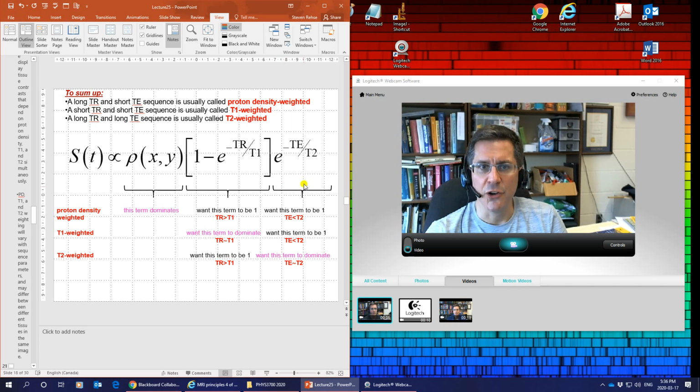All the action is right here. And you ask yourself, is this term 0, which means dark, or is it 1, which means bright? Just ask yourself that. And you need to know this much math, which is not unreasonable to know. So you've chosen TE, whatever TE is. T2 for water, it was the biggest. So e to the negative something over something big. Whatever TE is, the denominator is huge. That means that this number is small. It's essentially 0. E to the 0 is 1. So something with a big T2 makes this whole term 1, which means it's bright.